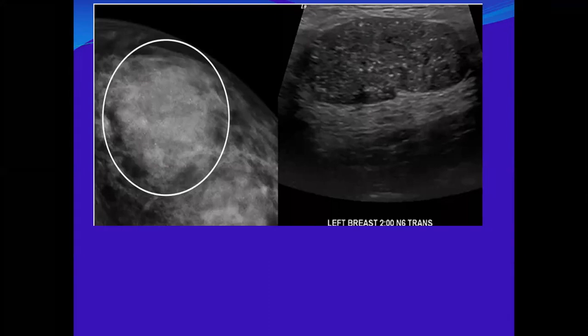So based on this spot mammography, before going for ultrasound, you are going to report it as BI-RADS 5. I will put it at 5. Why 5? Because of the indistinct mass with associated amorphous calcification. Okay. But for indistinct margins, we said it is BI-RADS 4. Yes, we said it is BI-RADS 4, B or C.